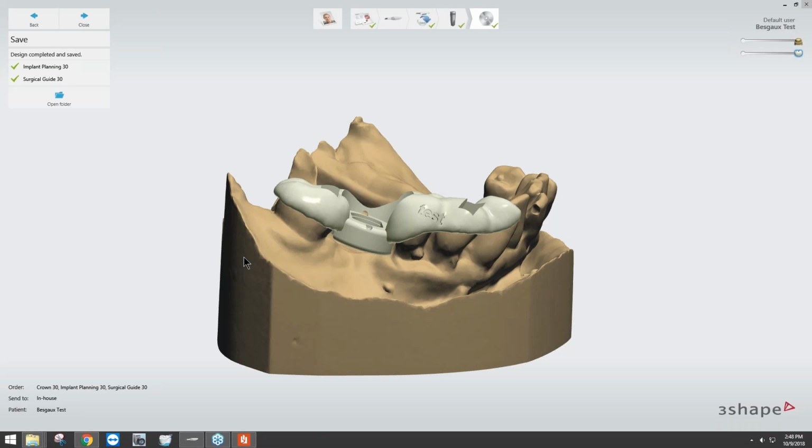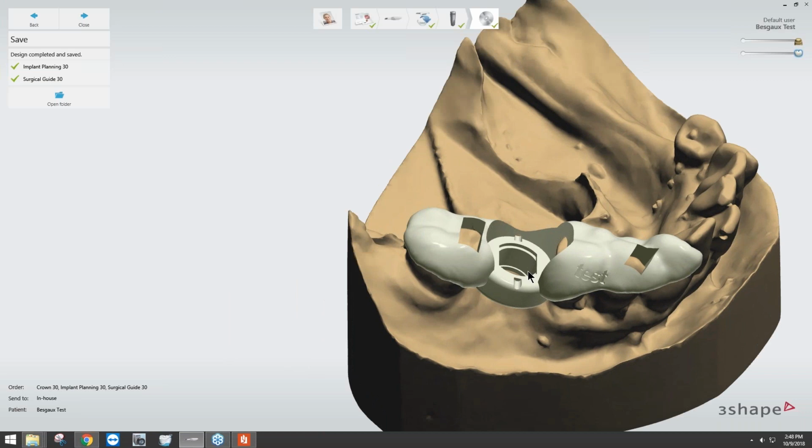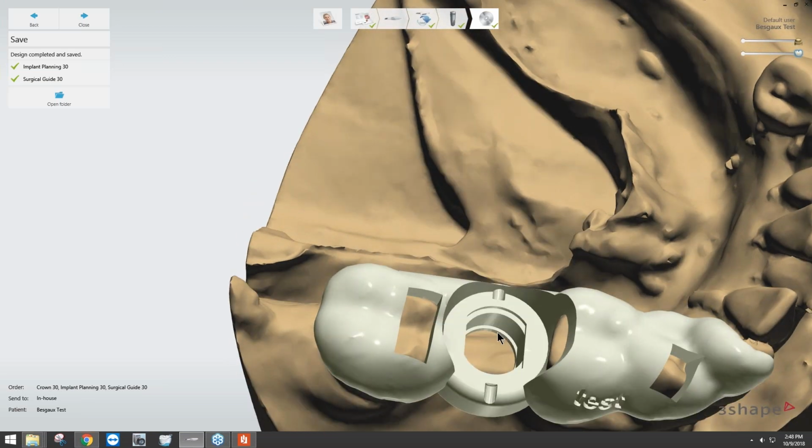The main reason is most nesting programs utilize round-tipped milling burrs, which aren't able to get at a lot of the sharper corners that you see for the sleeve. You'd normally need to have a flat edge milling burr and strategies to go along with that to mill it out. But I do know a couple labs that are producing it that way.